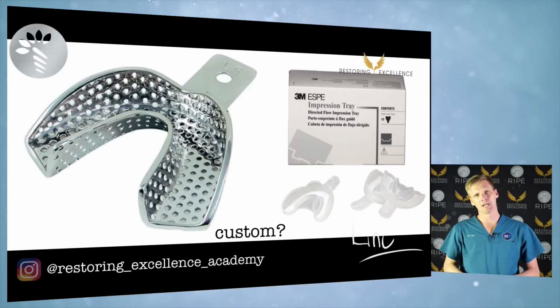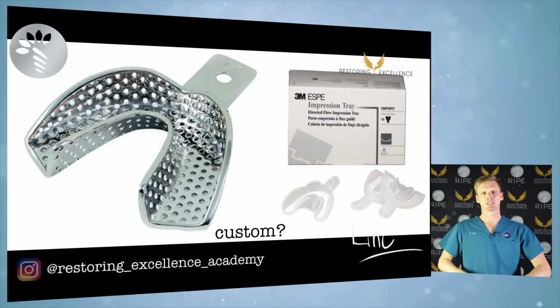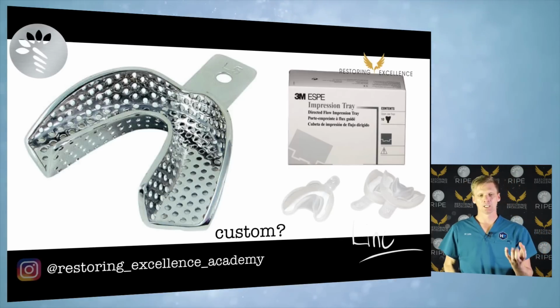I use the metal tray. If I'm using putty, I'll often use a metal tray with perforations just because I want something super rigid that won't distort when I'm pushing that putty down, because you get massive resistance as you're pushing it down. That's why it gives good impressions, okay? But it's also why it can distort your tray.